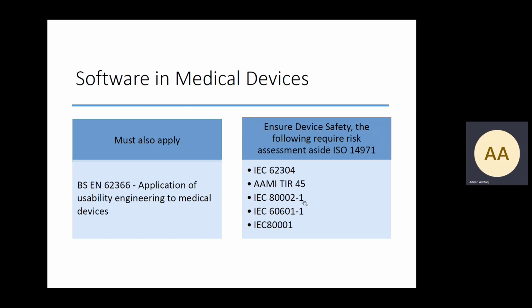And 80002 specifically looks at risk management from a software perspective. So it's also advisable to have a look at 80002 in addition to 14971, even although 14971 is really incorporated into 80002, it's worthwhile having a look at both.